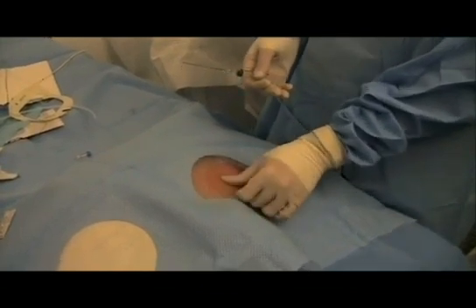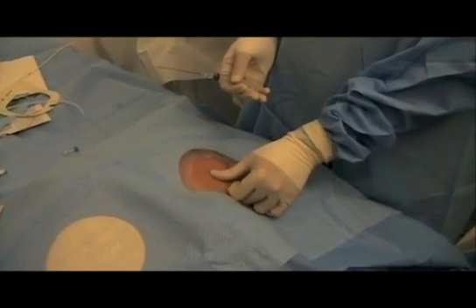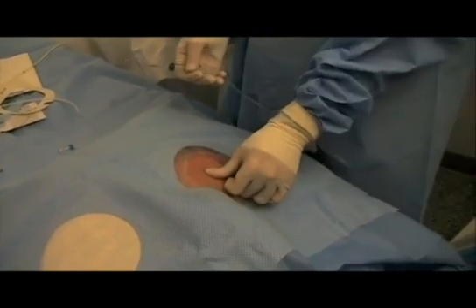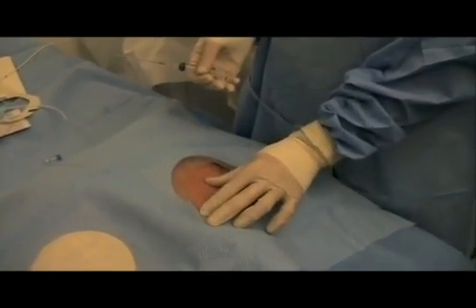It does have a higher complication rate in the hands of inexperienced operators. Once you get experience with this line, the complication rate is quite low. But you can't use ultrasound, unfortunately — at least not yet. So you do have to become skilled at landmark placement.